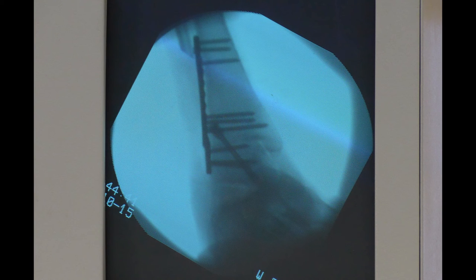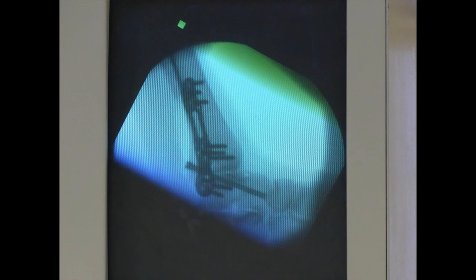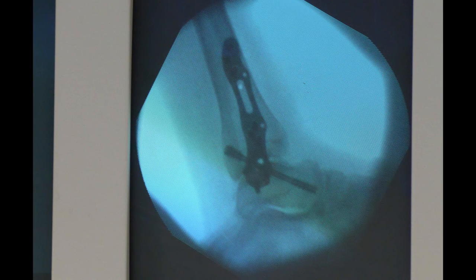The final fluoroscopic images are taken to check the fixation and make sure that no screws lie within the subtalar joint. Closure proceeds as guided by the operating surgeon. We recommend resting the operated area in plaster of Paris back slabs until the wounds are clean and dry. Weight bearing can be commenced dependent upon surgeon preference and the stability of the arthrodised ankle joint.